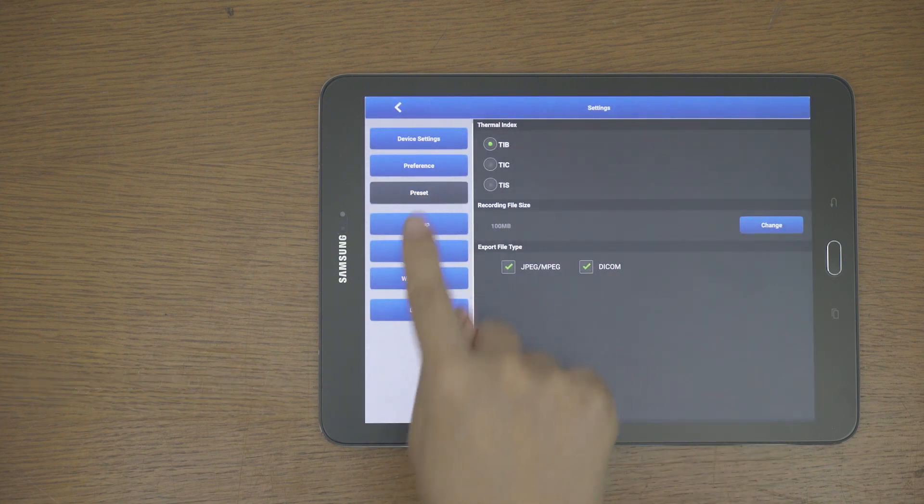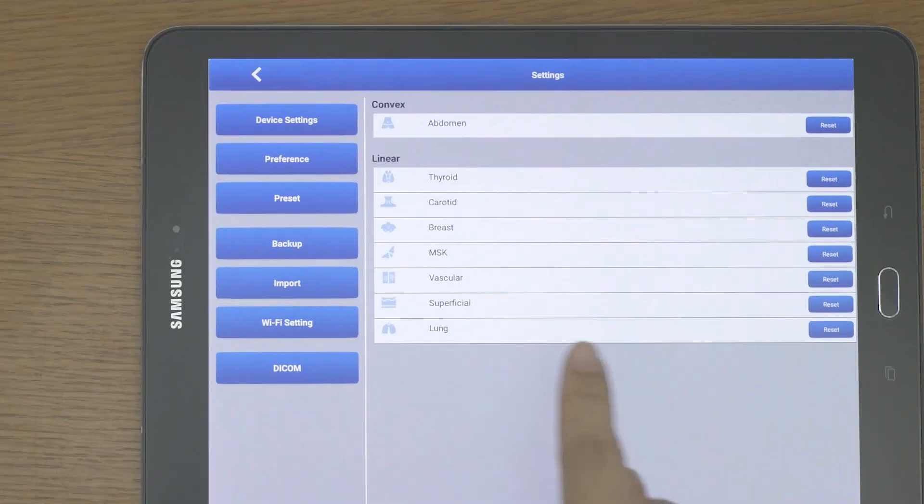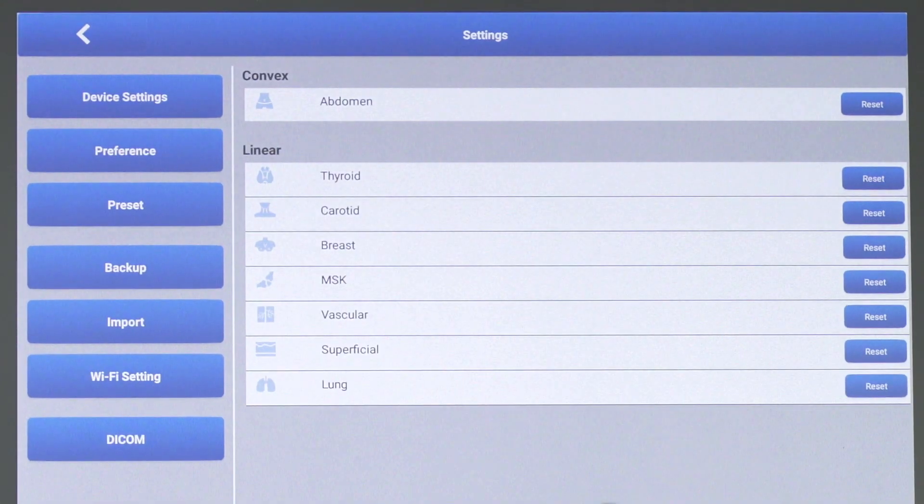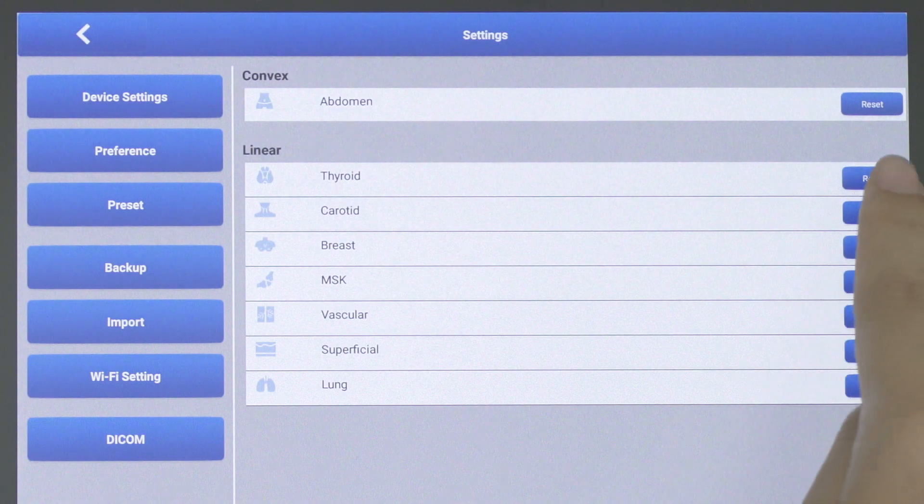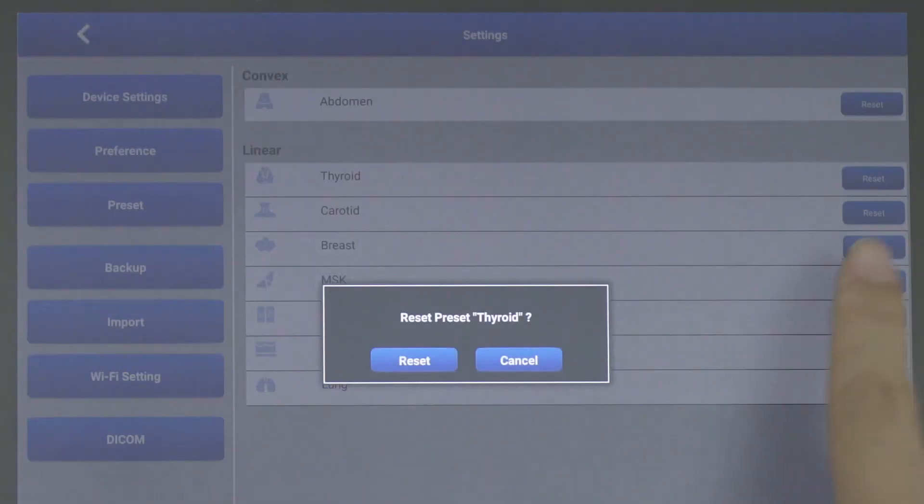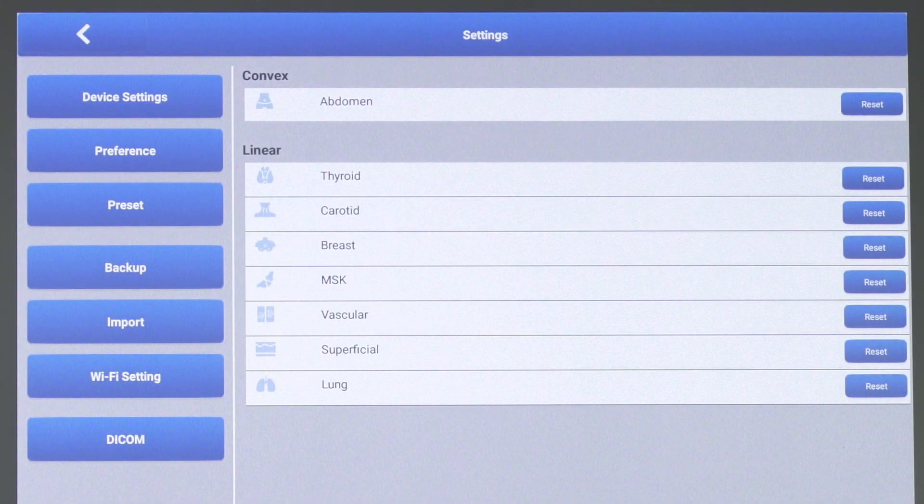In the Preset screen, you can return the preset you created or modified back to its original value and even delete it.